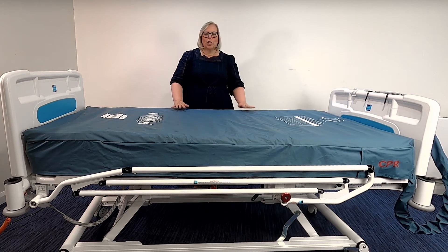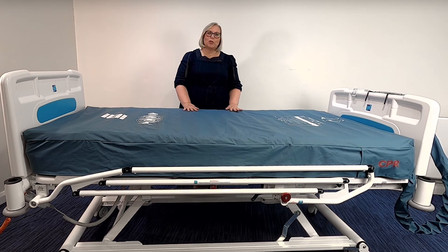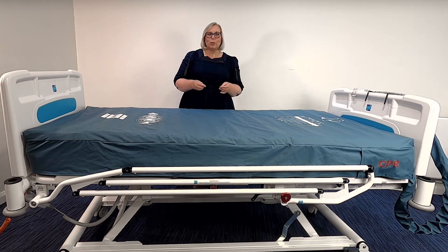Ensure there are no sharp objects around the vicinity of the mattress. You also need to ensure that any bed sheets used on the mattress are fitted loosely to reduce the hammock effect. Any tight-fitting sheets may interfere with alternation. During normal operation, the control unit monitors the mattress pressure and maintains it at a set level. If the pressure falls below the set pressure level, the control unit will automatically speed up the inflation of the mattress until the correct pressure is achieved.